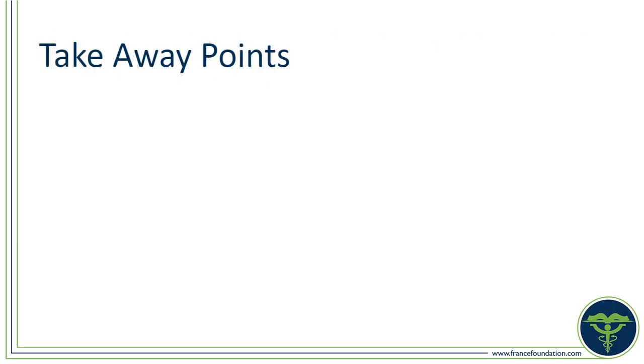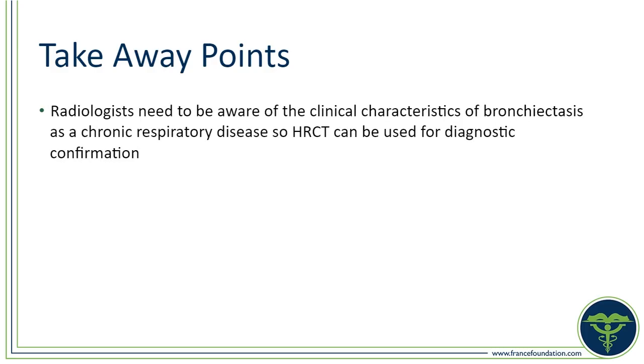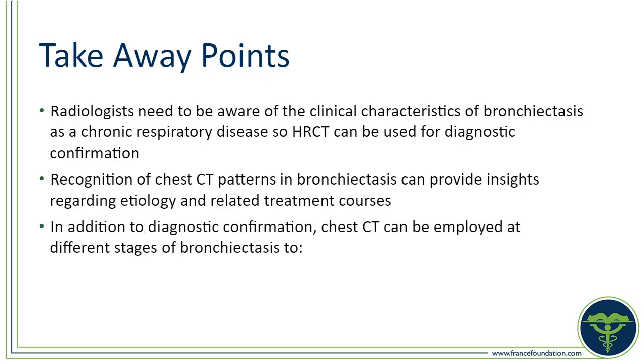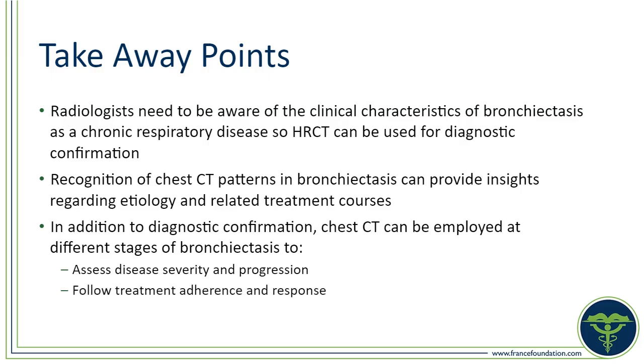When we are looking at some of the takeaway points from today's discussion, we are left reviewing that radiologists need to be aware of the clinical characteristics of bronchiectasis as a chronic respiratory disease, so high-resolution CT can be used for the diagnostic confirmation. The recognition of these CT patterns of bronchiectasis can provide insights regarding the etiology and related treatment courses. In addition to the diagnostic confirmation, CT chest can be employed at different stages of bronchiectasis to assess disease severity and progression, follow treatment adherence and response to therapies, and educate patients on their disease and its treatment impacts.